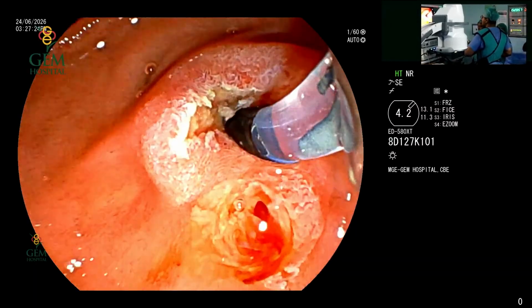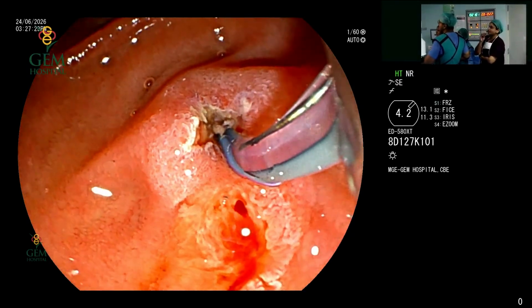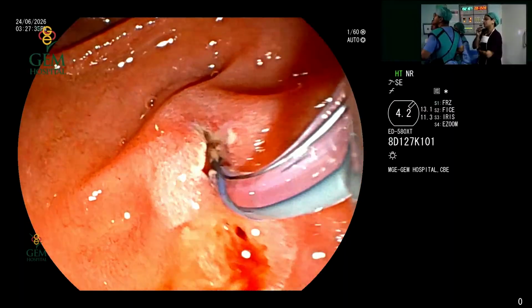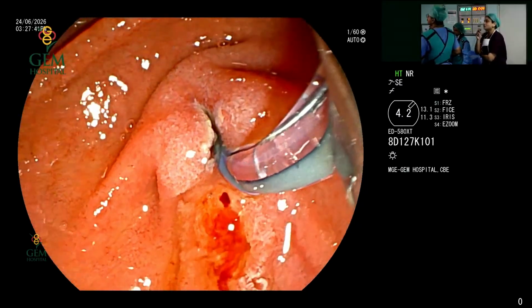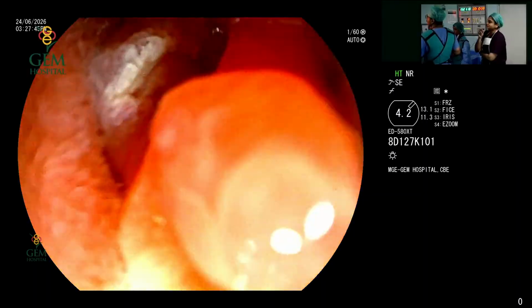So we are continuing to attempt the cannulation as of now. As you all saw, we had difficulty cannulating through the major papilla. We have tried the access through our fistulotomy now. As sir would have already mentioned to you, mostly we are attempting in a normal caliber CBD with the background of a passed out CBD calculi.